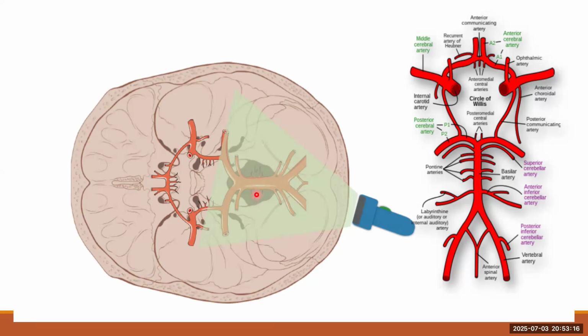Possibly the other lateral branches would indicate the superior and the inferior cerebellar arteries and the anterior inferior cerebellar arteries, which are rare to find. The PICAs would be the most commonly insonated along with the vertebrals and the basilars.